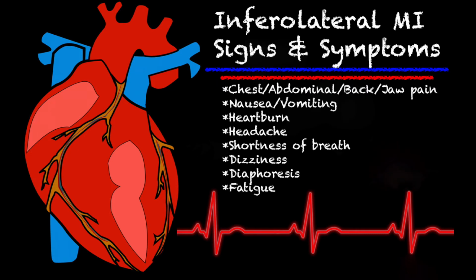Some of the signs and symptoms can be abdominal pain, chest pain, back and jaw pain, nausea and vomiting, heartburn, headache, shortness of breath, dizziness, diaphoresis, and fatigue. Let's go ahead and take a look at an inferolateral on an actual 12 lead.